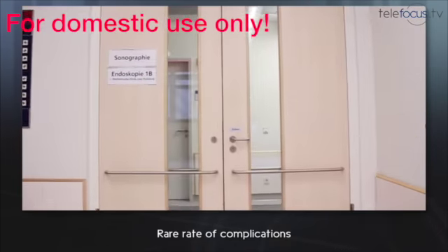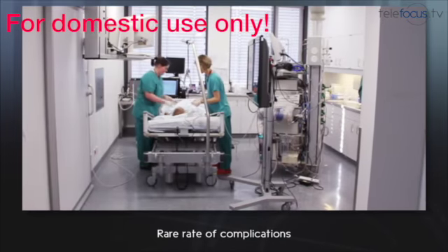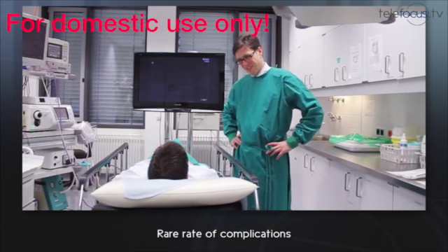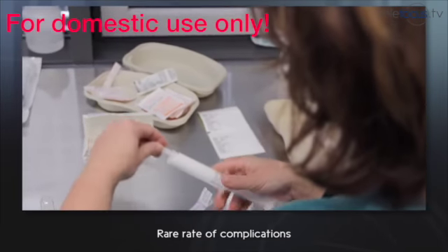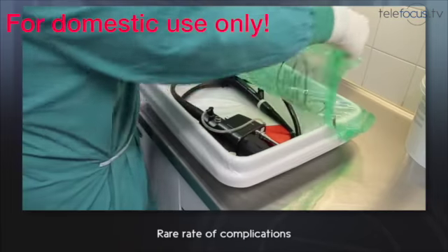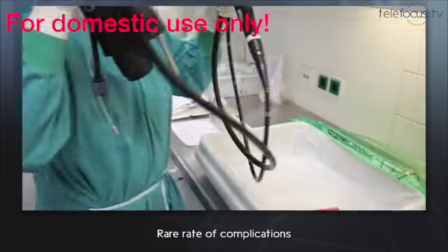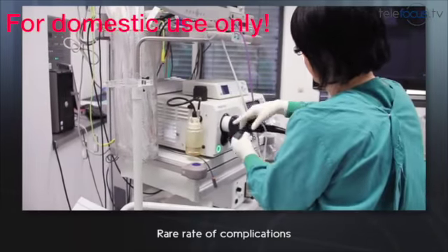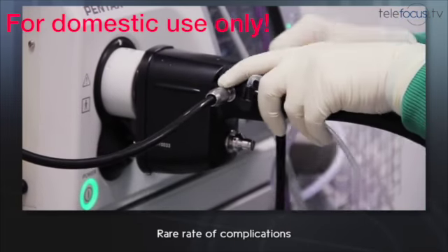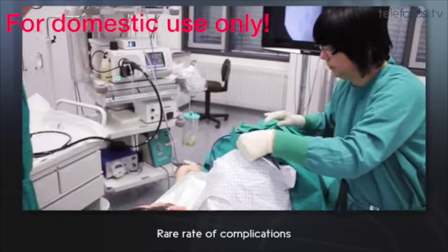The gastroscopy is used for exploration of the upper gastrointestinal tract. It enables the physician to detect conditions that are causing your symptoms and to identify potential pathological findings and provide treatment. Despite the physician's high diligence, there may be complications in individual cases. Nevertheless, a gastroscopy is a low-risk intervention.